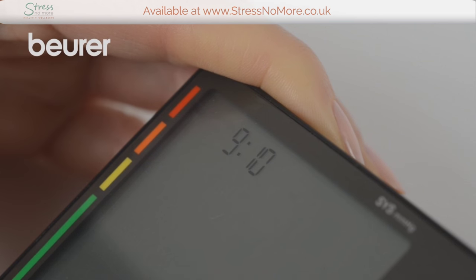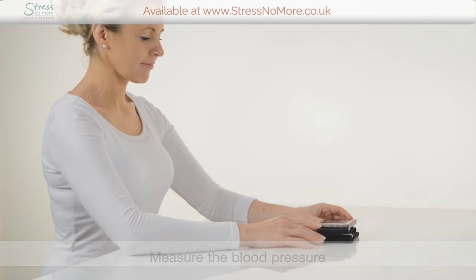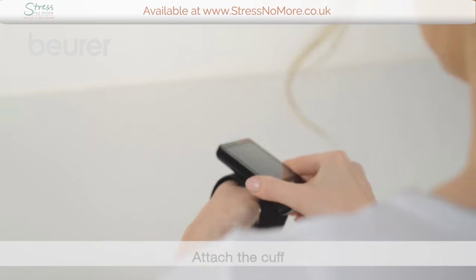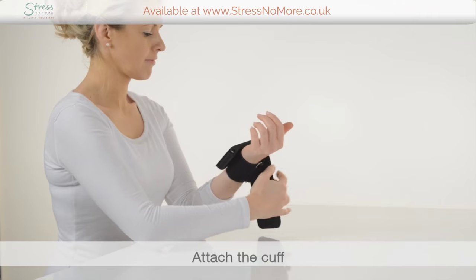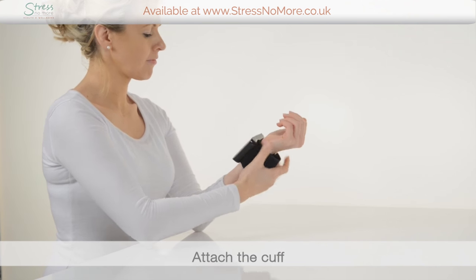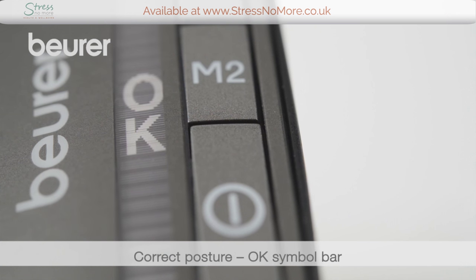Let's move on to measuring the blood pressure. The measurement can be performed when sitting or when lying down. Adopt a comfortable posture. Place the cuff on the inside of your bare left wrist so that the upper edge of the device is positioned approximately 1 centimeter underneath the heel of the hand. The cuff must be level with your heart. If the device is in the correct position, the OK symbol is visible.